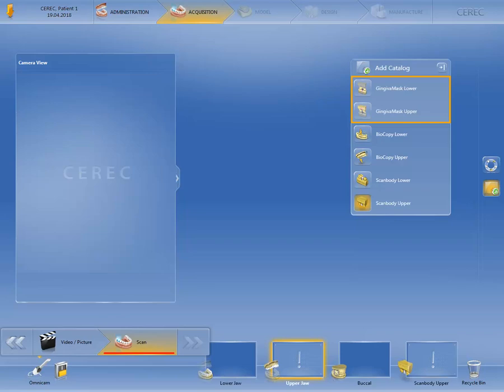This image catalog can be displayed and hidden during modification of the design in the design phase. In this way, the emergence profile of the restoration can be optimally adjusted.